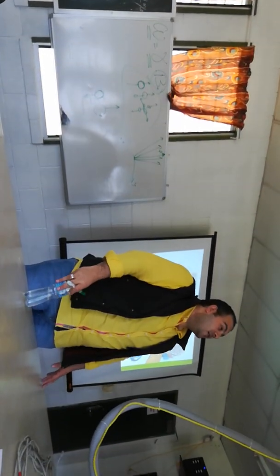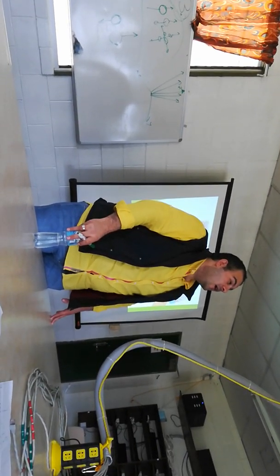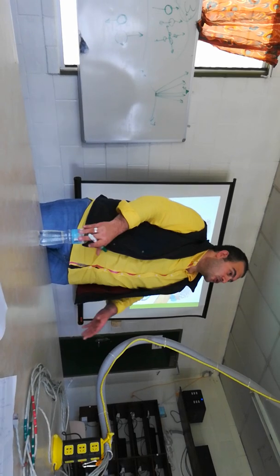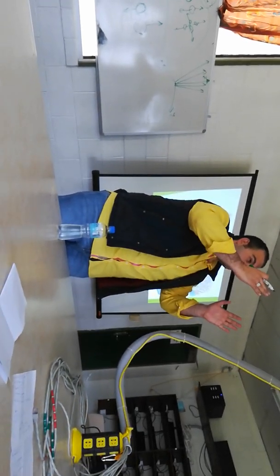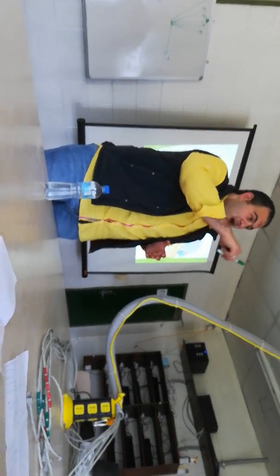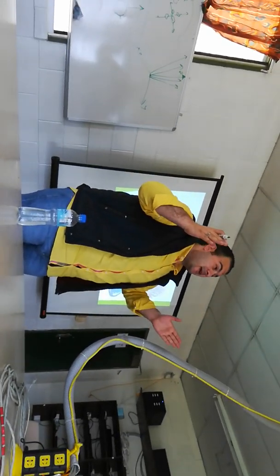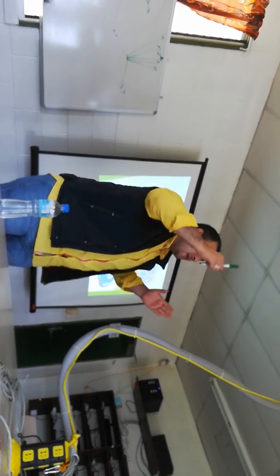First you had the protons in a random fashion, but in the MRI machine, from the magnetic source, they are now in an ordered fashion. The protons will be aligned straight with the lines of the magnetic field, and will acquire a precession frequency. This precession frequency depends on the external magnetic field. When we are using a higher magnetic field, the precession increases.